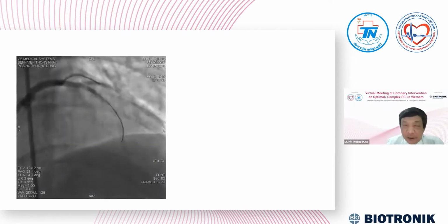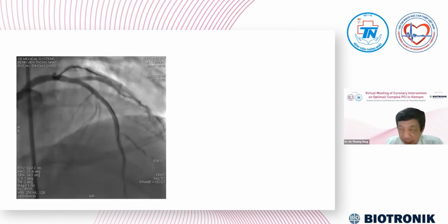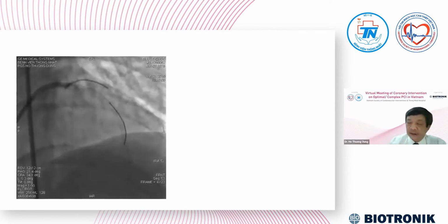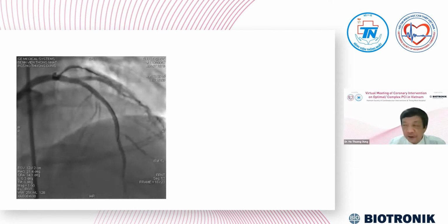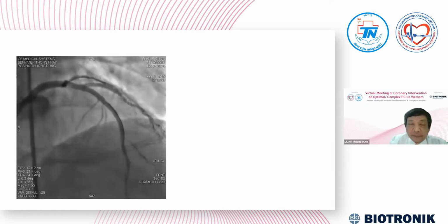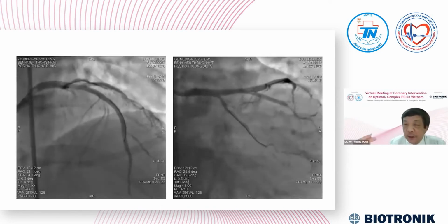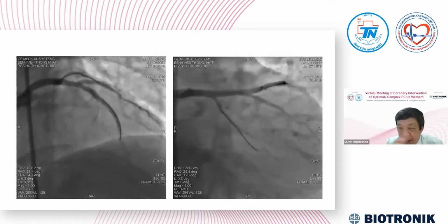We didn't record the OCT before we did PCI, but we recorded the OCT after, and one year after that, but yesterday I looked for the OCT file and did not find it. But yes, I think this is the final result, and with the result of the PCI, I think the circumflex may be bigger.